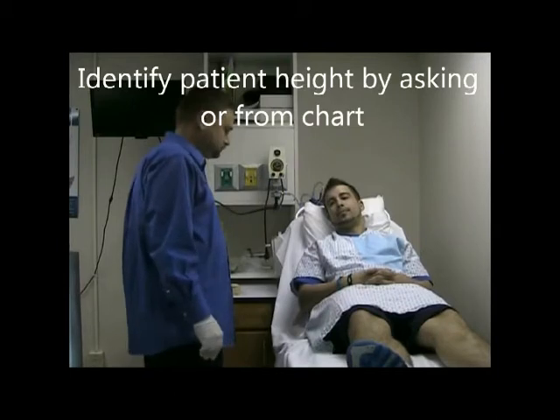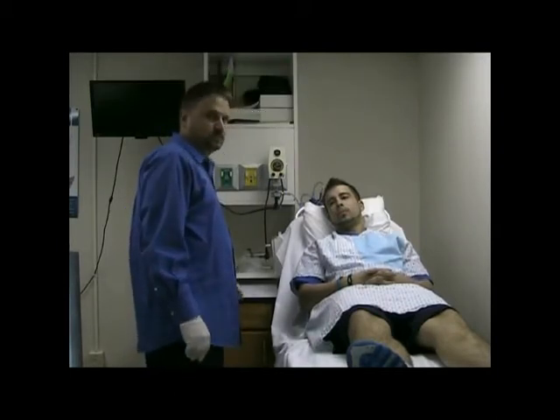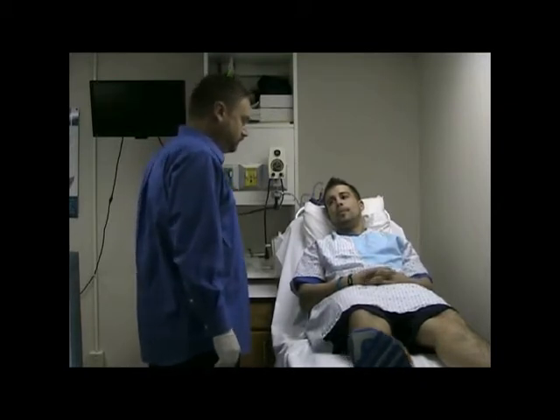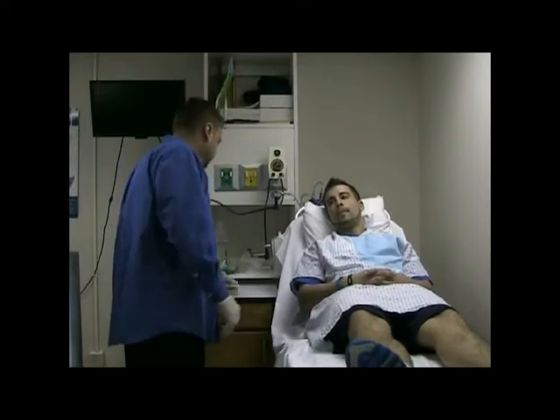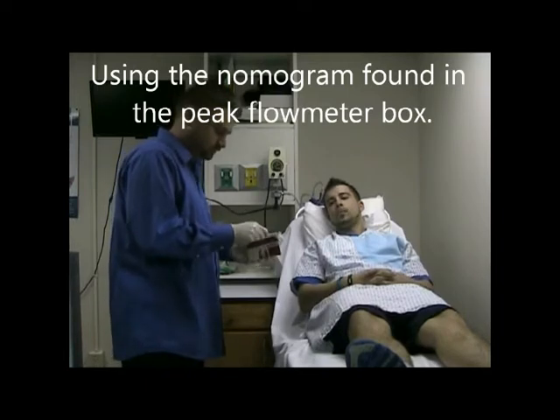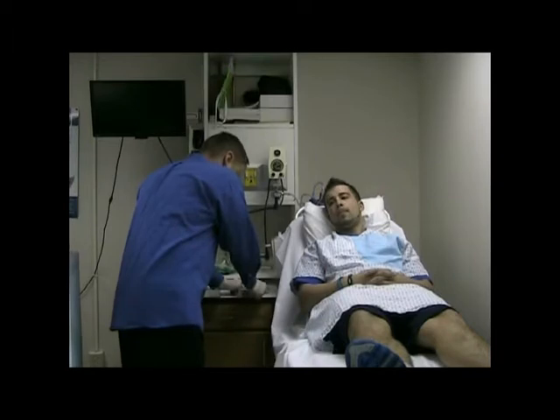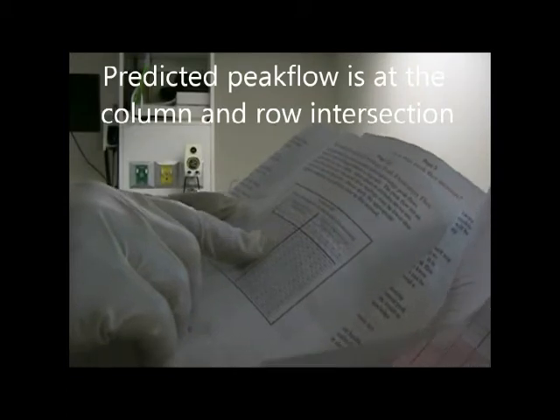Identify the patient's height so that you can calculate the predicted norms. His height is 5'8". My patient is 25 years old. Using the insert within the box, you will identify his normal peak flow range. Matt's 25 years old and his predicted peak flow will be 550.